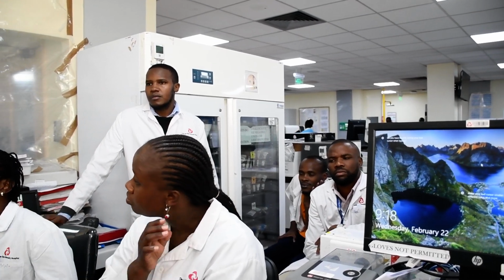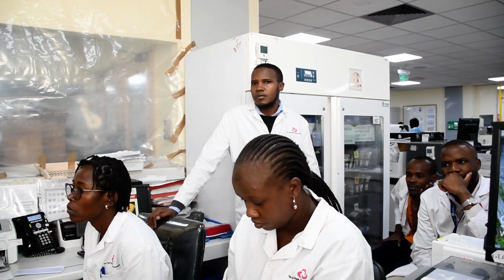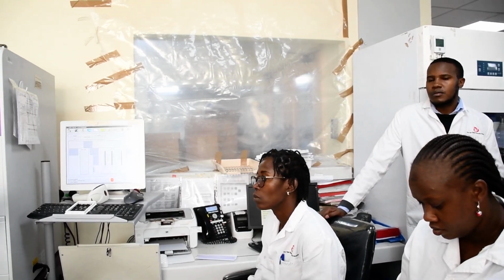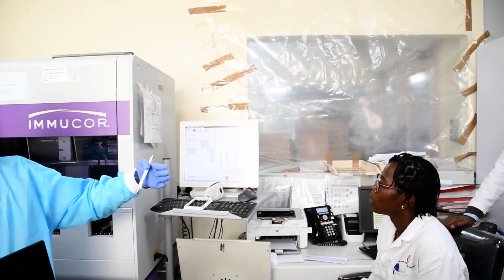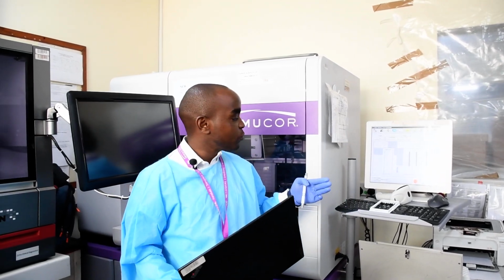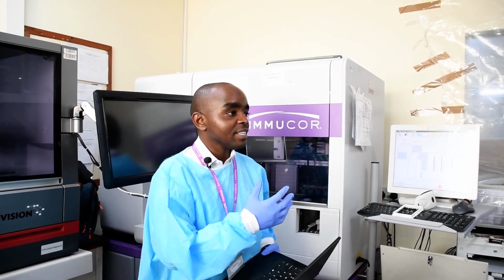So in one sample, you can run it together for IgG and IgM because they are using different plates. And of course we always recommend, because anything capture takes more time, you first start the capture, and then you can set the one for the untreated microplates. Yes, so you can run it together.